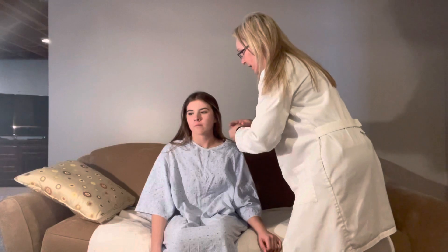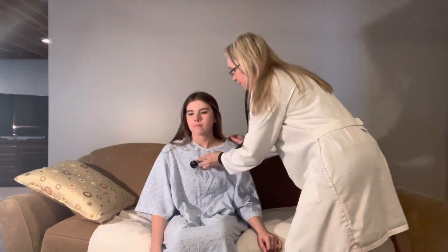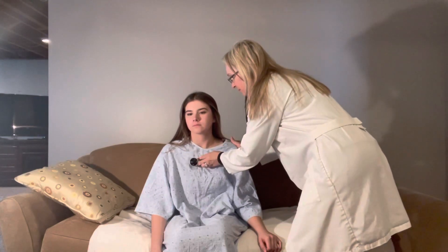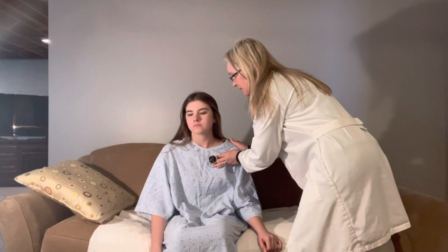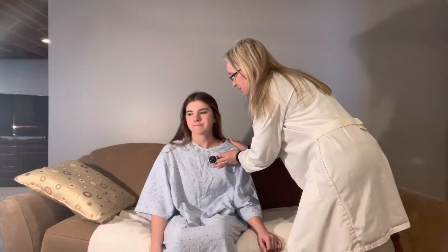I'm going to listen with the bell again at the same areas that I listened to.